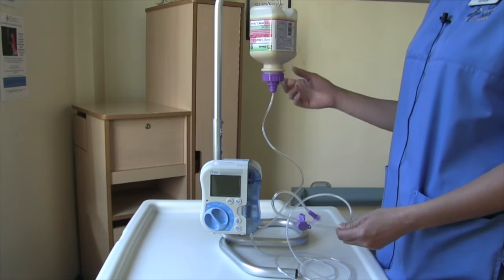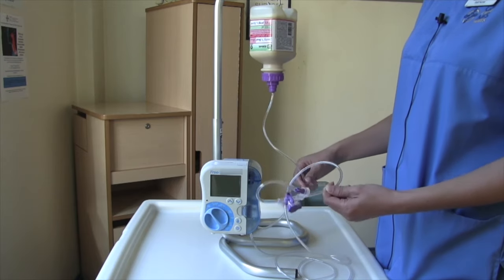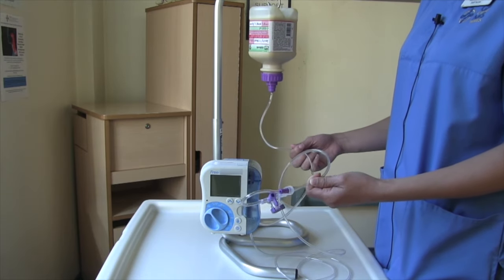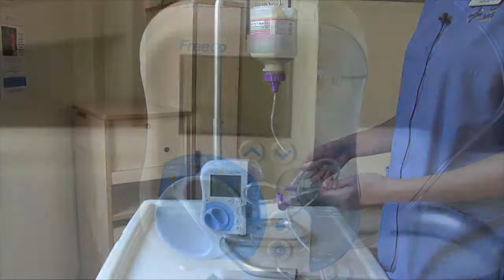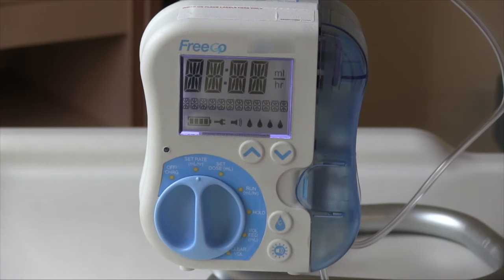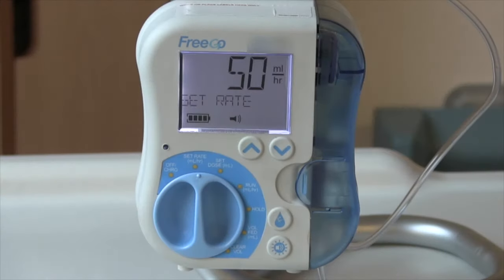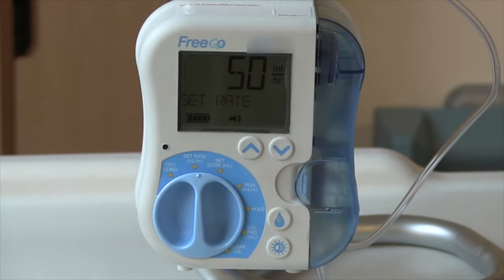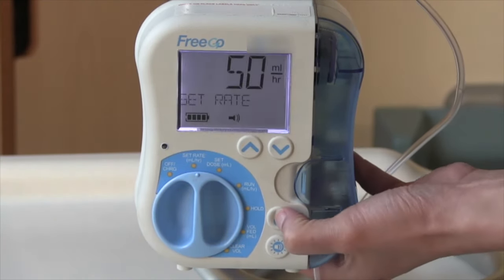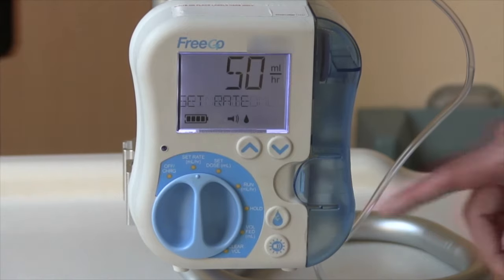Once you have set up the giving set to your feed and pump, you will now be priming your tube. Priming is when the feed gets pulled into the tube while pushing the air out. We want to prevent the air in the tube going into your stomach as this can cause discomfort. To turn on the machine, turn the dial to set rate. The pump will go through a self-test — you will need to wait until this is completed to program the pump. To prime the tube, find the raindrop button on the right side of the pump. Push down on the raindrop button for 2 seconds until you hear a beep. You will see on the screen display it says priming and you will begin to see the feed go through the tube.